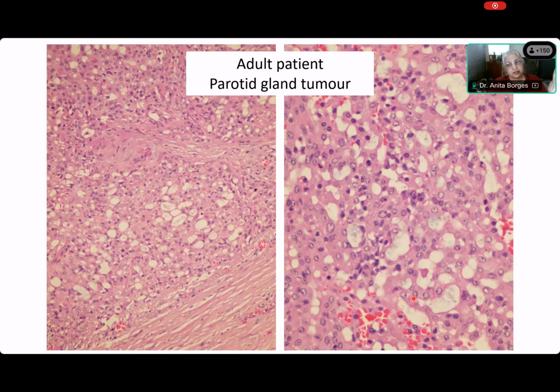Now, where are the spaces? Are they just sitting by themselves? You can see that there are sheets of cells, and in these sheets of cells, somebody said slit-like. Priyanka, these are not slit-like. A slit, do you know what is a slit? A slit is a very thin space. These are spaces which are very irregular, and they seem to be forming within these sheets of cells.